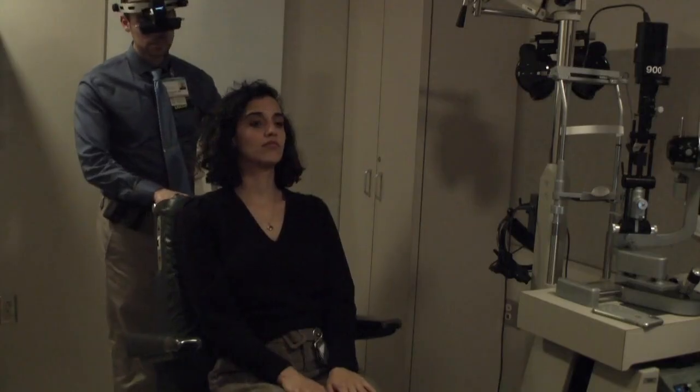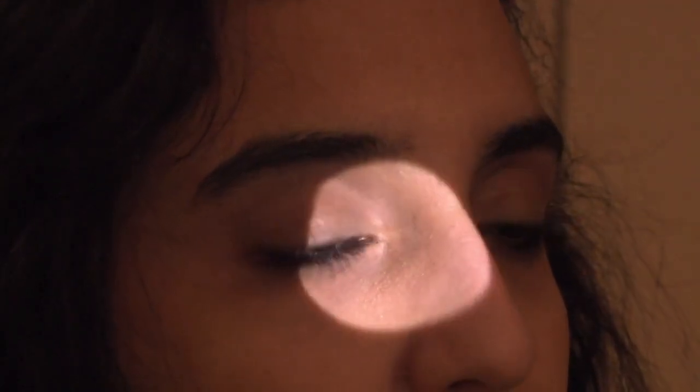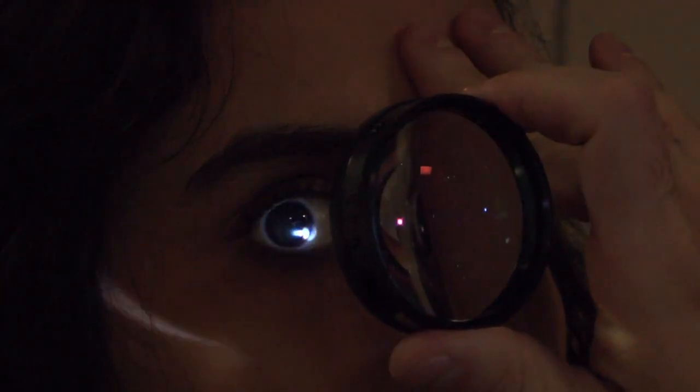The patient may be reclined or seated for this exam. Start with the right eye. Find the red reflex with the headlight. Then take the lens between your thumb and forefinger. Balance your middle, ring, and pinky fingers on the superior orbital rim and swing the lens in front of your field. Your light beam, the lens, and the retina must all be in a single plane.